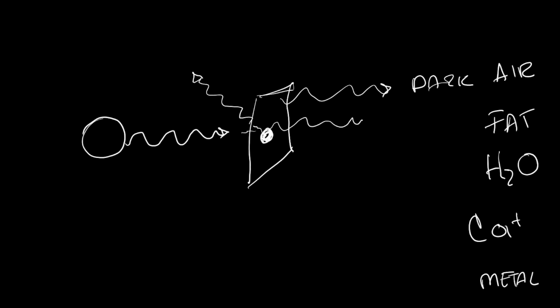And this is the famous grayscale of X-rays. Being white is what we call radio opaque, like metal, and dark is something that we call radiolucent, like air. The X-rays cross easily through air, and very hard through things like metal.